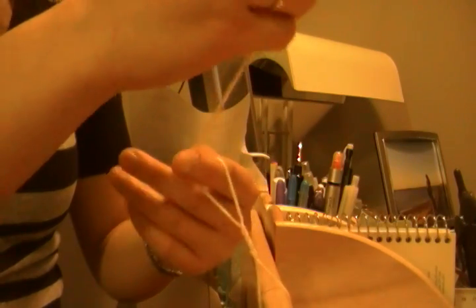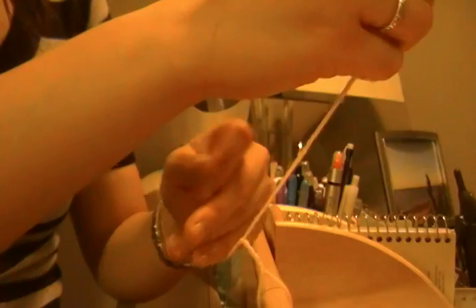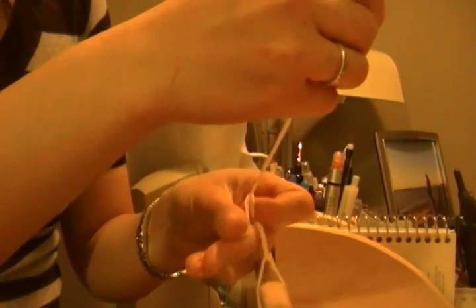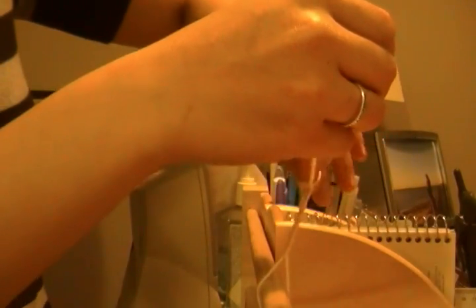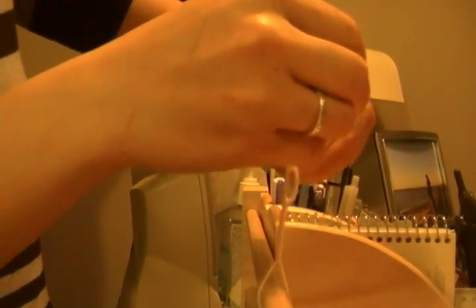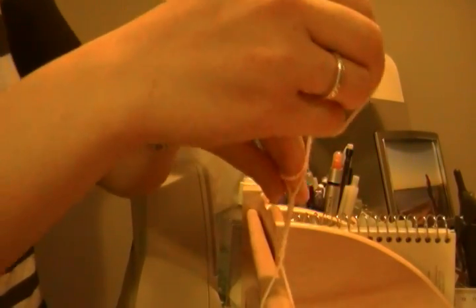This hand is just staying in one place, and I'm keeping it around like that. You can see how you can very easily even use a short piece and finish off a bunch of sutures if you really need to. That's the one-handed tying technique.